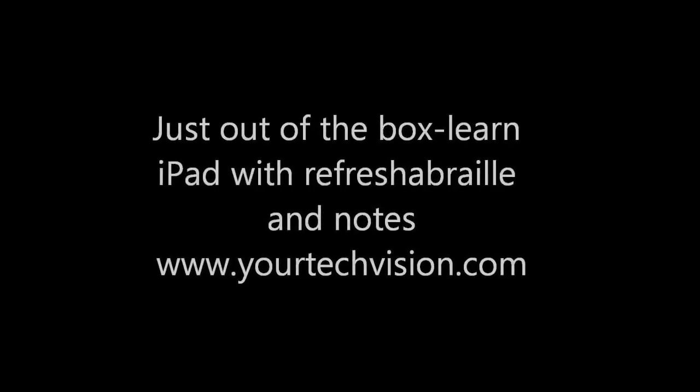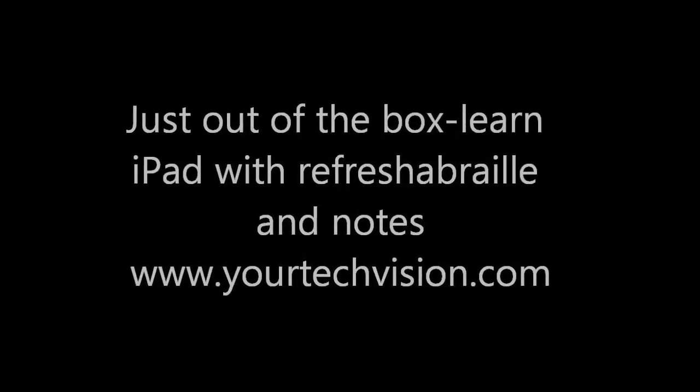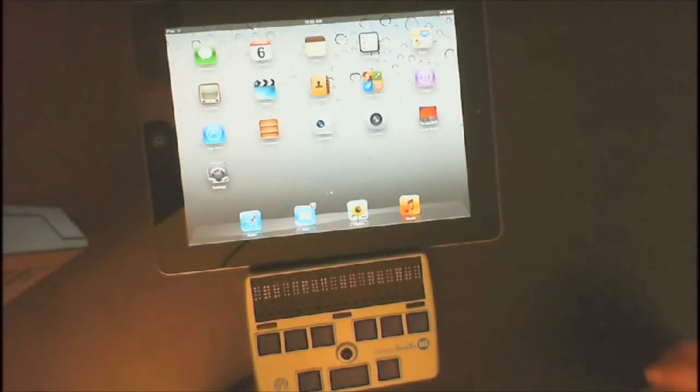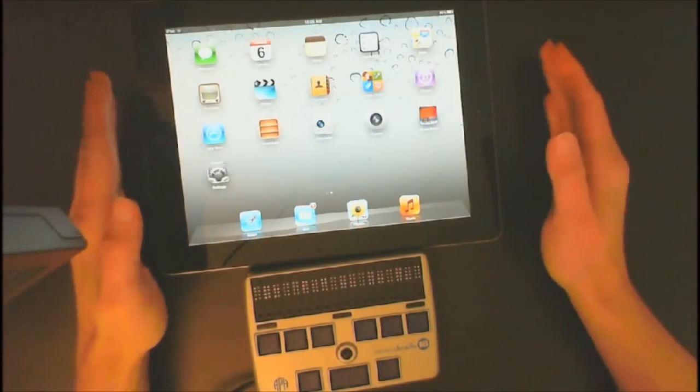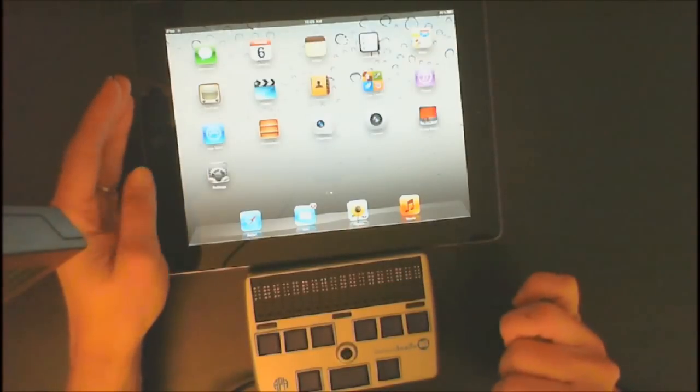Get your iPad out of the box and pair it with your Refreshabraille, using it with notes. Lessons at www.yourtechvision.com. Let's do a lesson as if you have just opened the iPad and you need to get it set up with the Refreshabraille display.